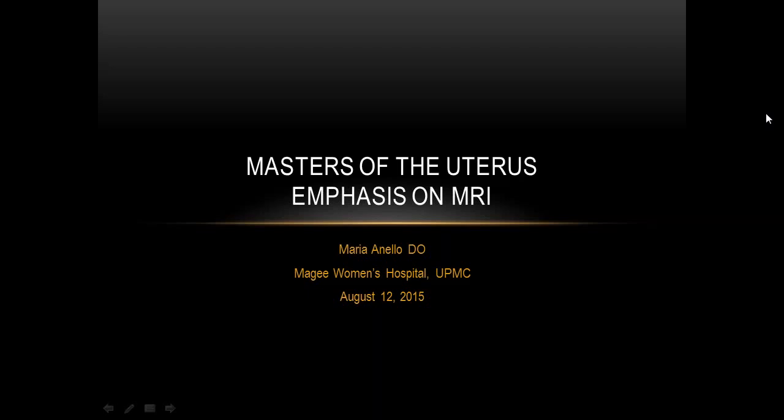Okay. Hi, my name is Maria Anello. I am at Magee Women's Hospital, UPMC in Pittsburgh, Pennsylvania. And I am going to talk about masters of the uterus with an emphasis on MRI.